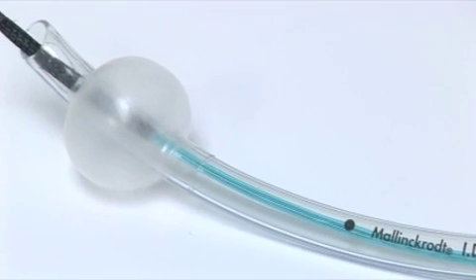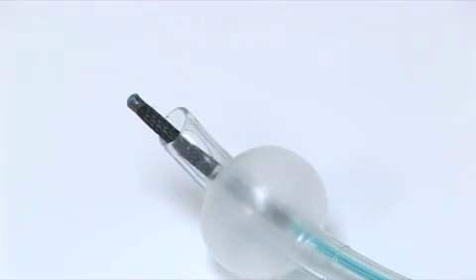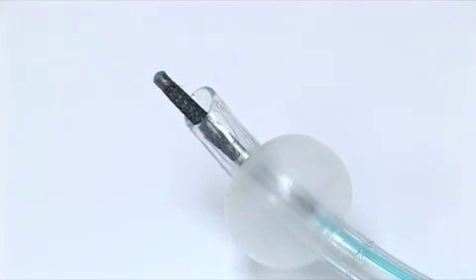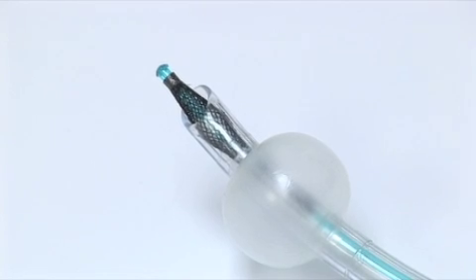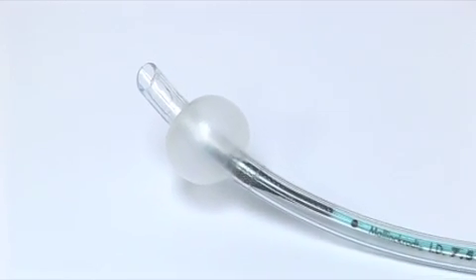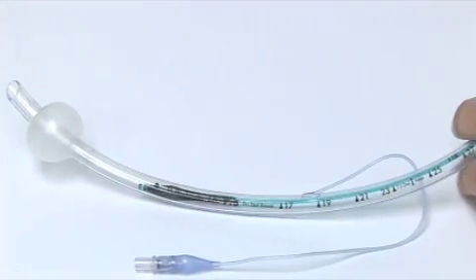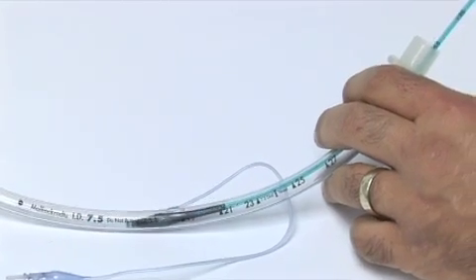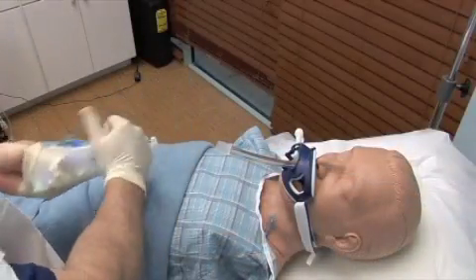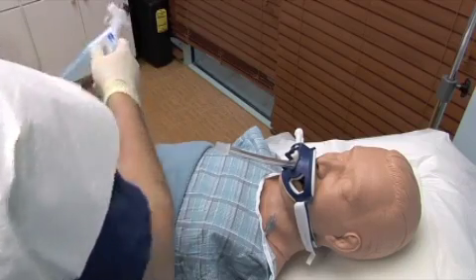Depending on the size of the endotracheal tube and the consistency of the secretions, it may be necessary to adjust the volume of air instilled in the balloon as the CAM Rescue Cath is withdrawn from the endotracheal tube. Reconnect the ventilator circuit tubing to the endotracheal tube.